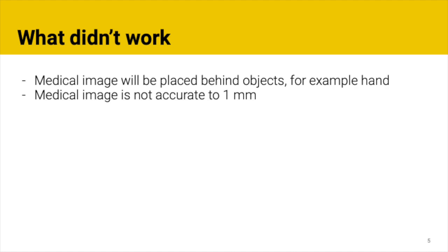The second feature is important because for the use of the app in critical medical situations, accuracy is essential. However, and especially for the automatic placement of the medical image, the AR image is placed in a way that is only accurate to a few centimeters. To improve this requires a more accurate automatic body joints detection. This could mean a manual development of body tracking that combines the use of machine learning and LiDAR, which is what makes higher accuracy a difficult task.